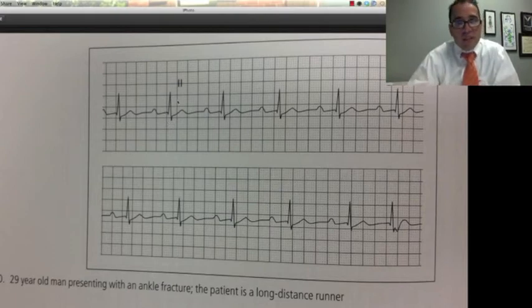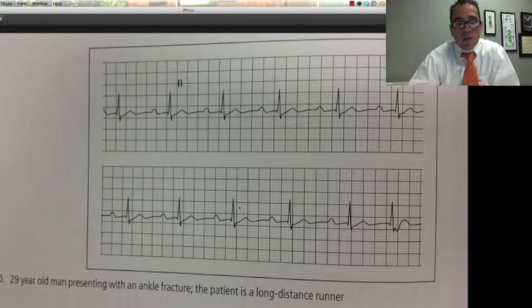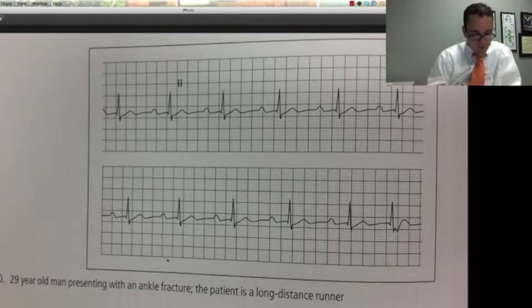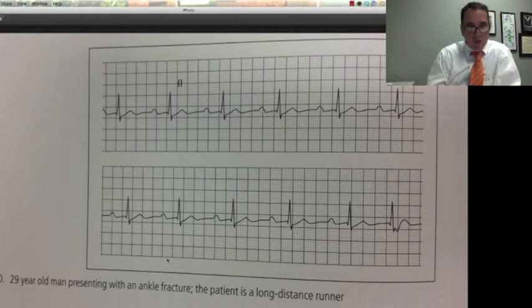The QRS is narrow, followed by a T wave, and then the next one. So patient is a long-distance runner after an ankle fracture — sinus rhythm with first degree AV block.